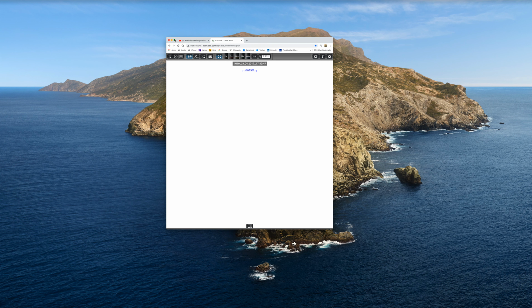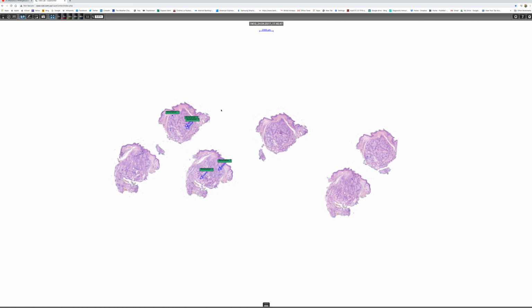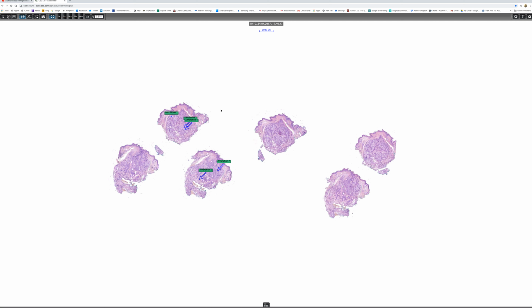I thought it would be rather nice to continue the theme of sweat gland tumors for beginners. And I've got two cases to show you in this presentation, which Antonina Kalmykova of CSD Health Care Kyiv shared with me. And they're both lovely examples of one of the more commonly encountered tumors, which is the mixed tumor of the skin, sometimes called chondroid syringoma, largely because some of them do show well-developed cartilaginous differentiation, although in these two examples, that's not very well represented.